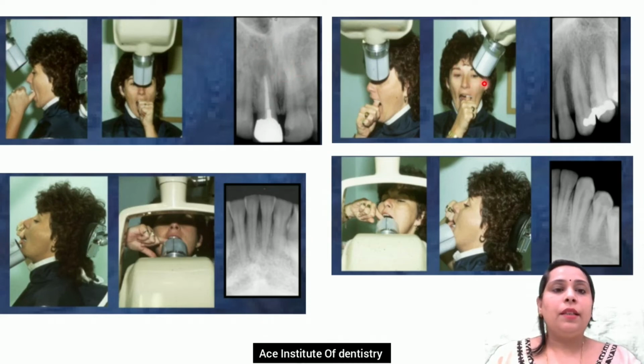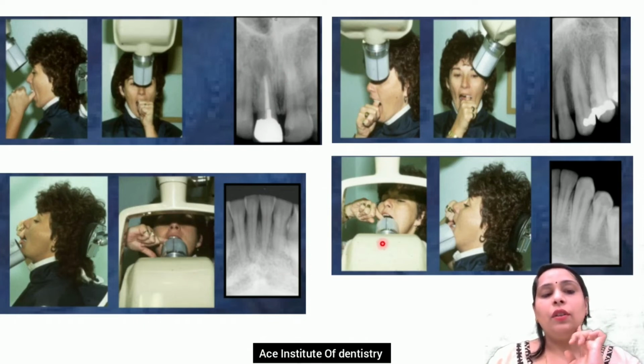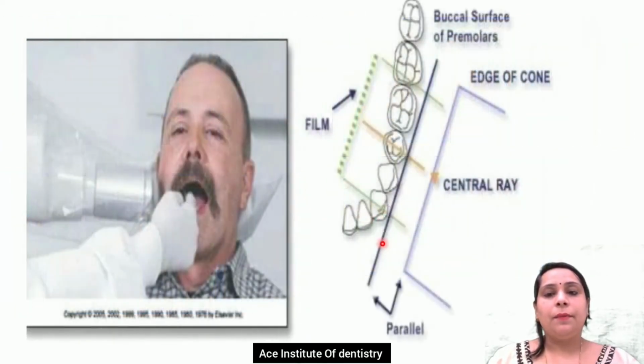Again for premolars, the chin, this area has to be covered. For the lower, it has to be placed from the down. Okay, for the lower canine from the lower side, like this area. We should follow the ramus of the mandible and keep the directions.